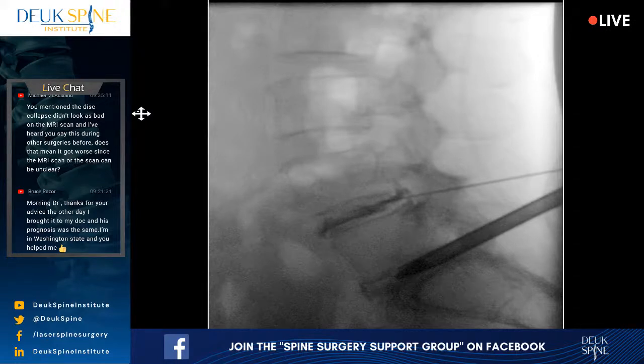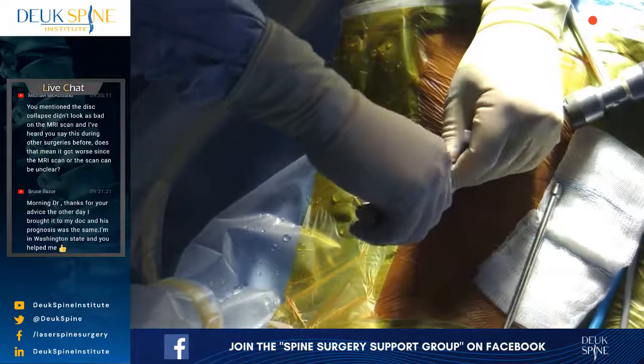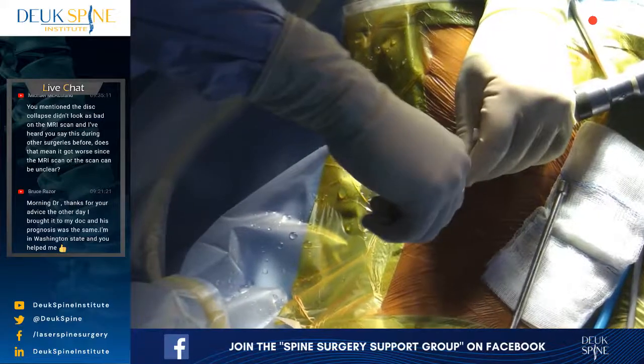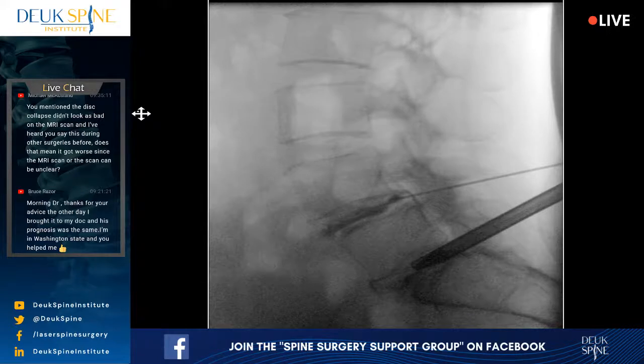Where is the tube? That's an interesting one. I can't tell if it's in the disc or not because it almost looks like a shadow by the facet, but I don't think that is. I'm not sure though. Let me have the tube distractor. I know, I think it is too, but I gotta make sure. I don't take any guesses, Sean. It looks like it's in the disc, Sean.